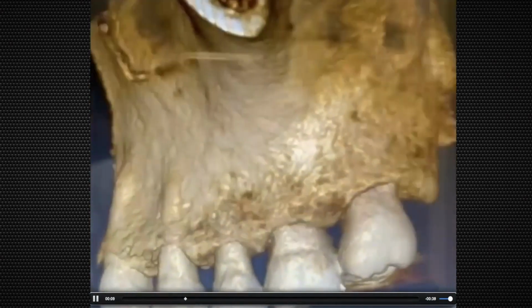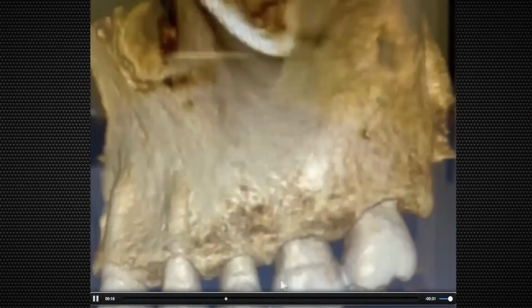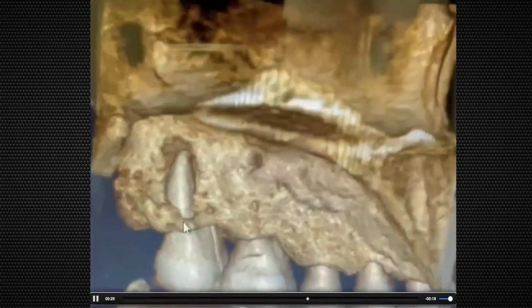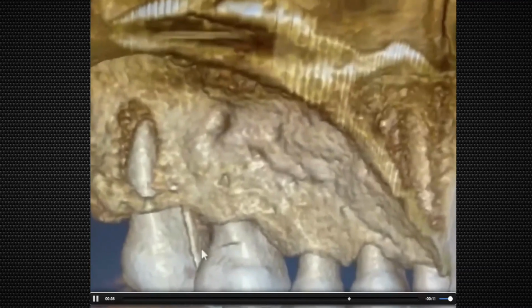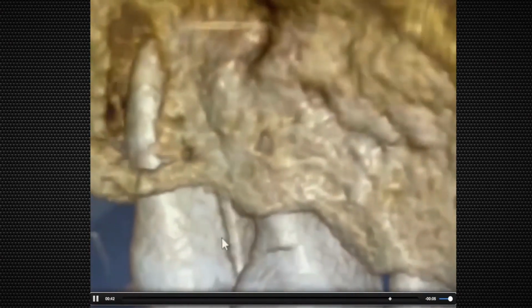This is another case that was tricky to diagnose. There is some periapical pathology going on. That looked kind of weird, so I decided to do a limited field of view 3D CBCT on this case. So this is the 3D bone rendering here from the buccal aspect. And on tooth number 15, which is here, everything looked pretty intact. But as we look at the palatal aspect, we can see that there is quite a bit of bone loss here on tooth number 15. And if you look very closely, you can see here she has a vertical root fracture that actually turned into a split tooth. You can see it right along here with the 3D bone rendering from the palatal aspect here.